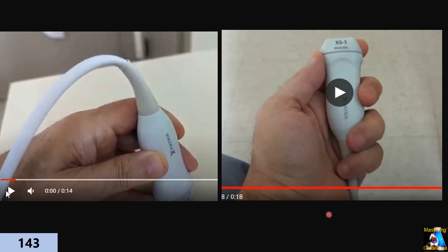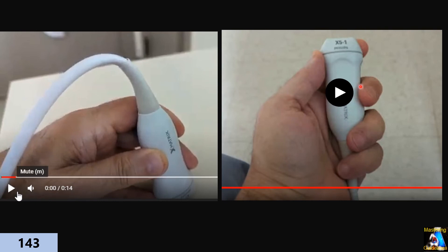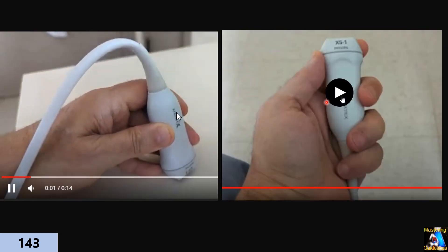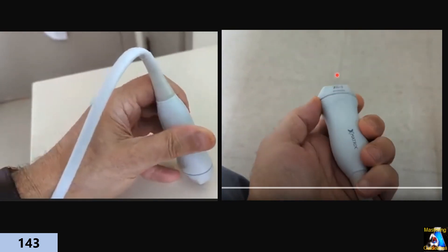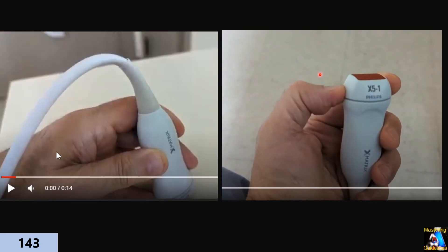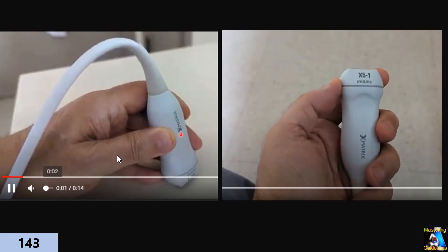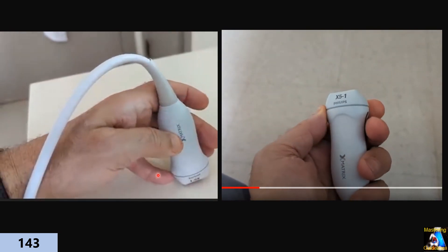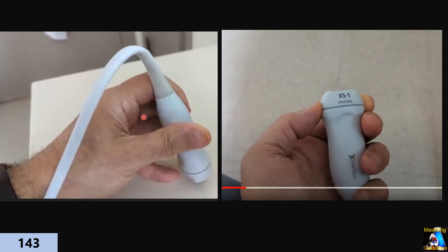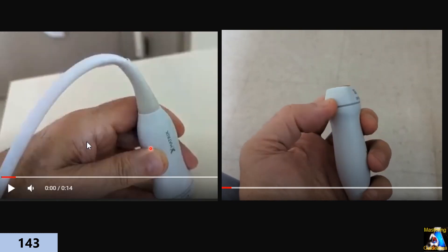For echo apical window, we use a five-finger grip and use the knuckle of the thumb and index finger to hold and keep the image steady — because in echo, a steady image is very important. The other fingers and thumb maneuver the probe up, down, and with twisting. For parasternal and subcostal and suprasternal notch views, we hold and maneuver the probe so that the hypothenar and knuckle anchor over the patient's body, controlling how much pressure is applied while keeping the image steady.